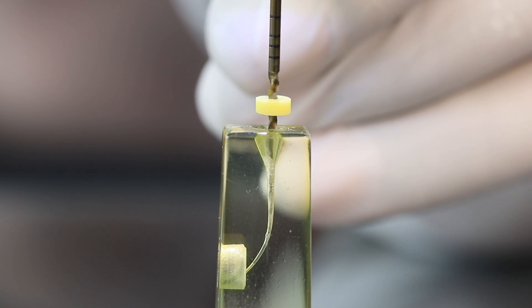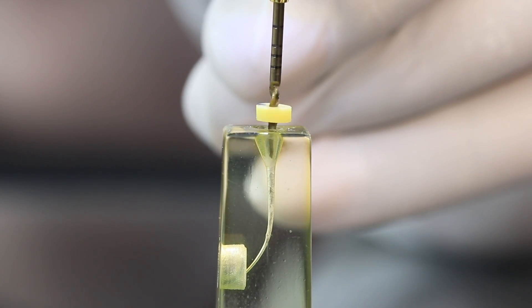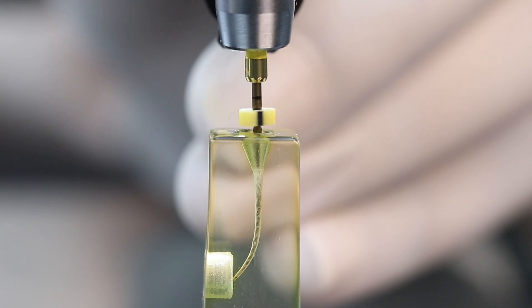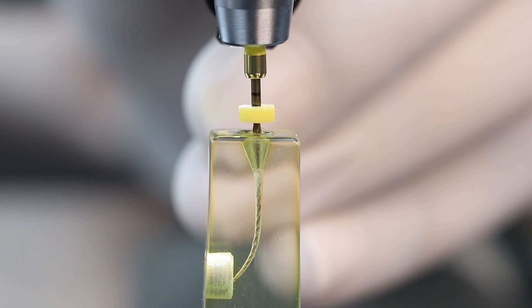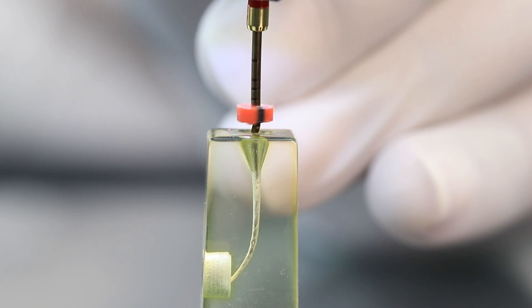For the preparation of the coronal two-thirds of the canal, we will be using a #20 file with 6% taper in the presence of a viscous chelator, for which we have used Walden RCT prep. For the preparation of the apical one-third of the canal, we will be using a #20 file with 4% taper and a #25 file with 4% taper.